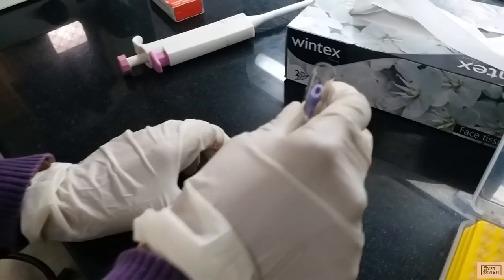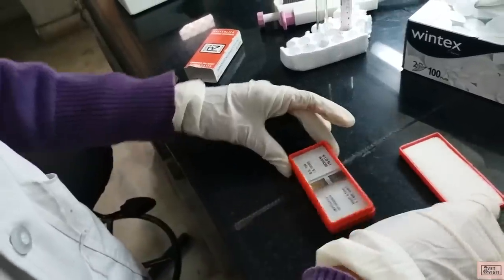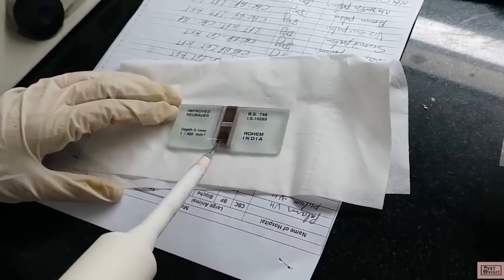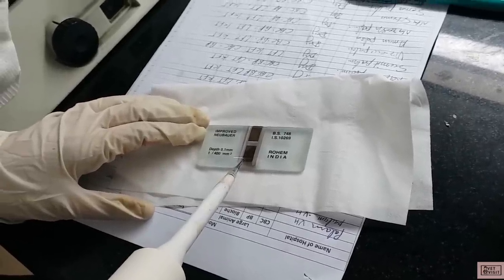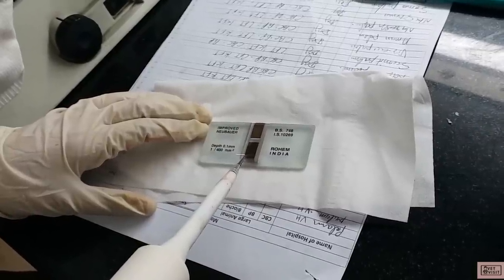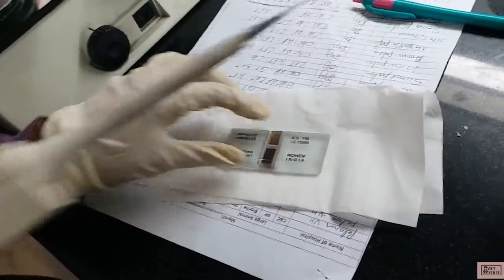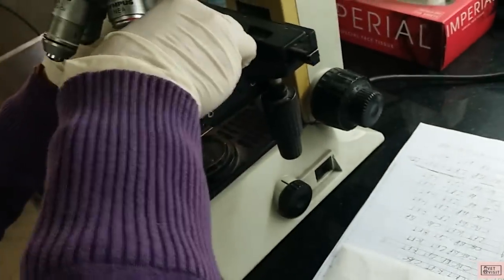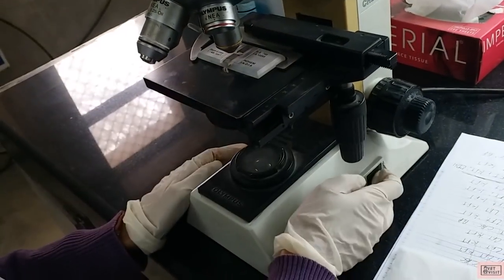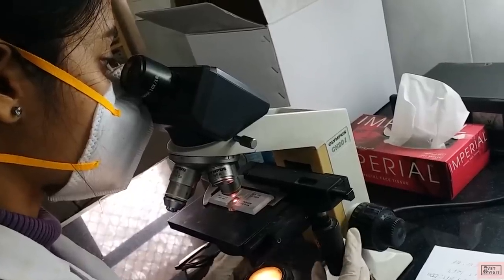Then add it to the diluting fluid and mix it nicely. We have to keep it aside for 5 minutes. In the meantime, focus the Neubauer counting chamber, place a coverslip over it, and carefully charge it. Make sure that there is no overflowing. Once charging is done, it is viewed under 10x power of the microscope. Count the WBCs in the 4 WBC squares and calculate the result.